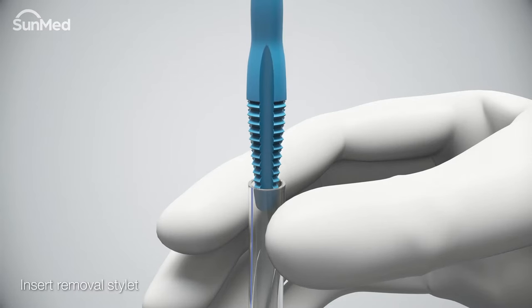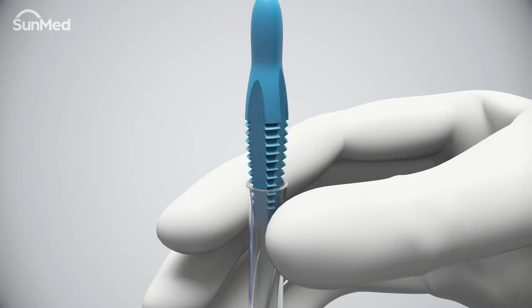Squeeze the tube and insert the tapered end of the removal stylet into the endotracheal tube. For air Q3 airway sizes 2.0 to 5.0, use firm inward pressure and rotate the removal stylet tapered tip in a clockwise direction until the adapter firmly engages.